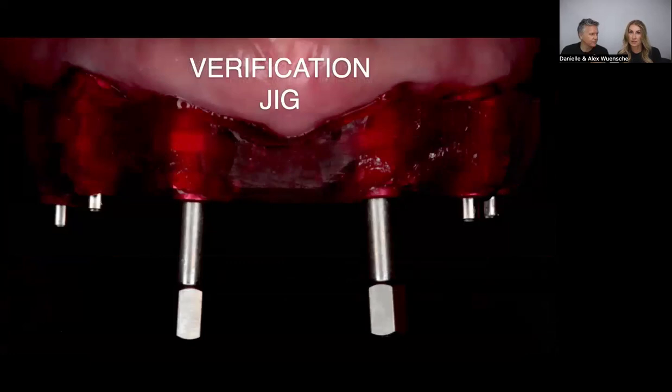So why is the verification jig so important, actually? Right? To establish the accuracy of transitioning what's exactly happening in a patient's mouth to the model. Yeah, the passive fit, right? Passive fit is like the key. So never forget, as soon as you have multiple implants connecting to each other, a verification check is a gold standard, right? That you should not skip.